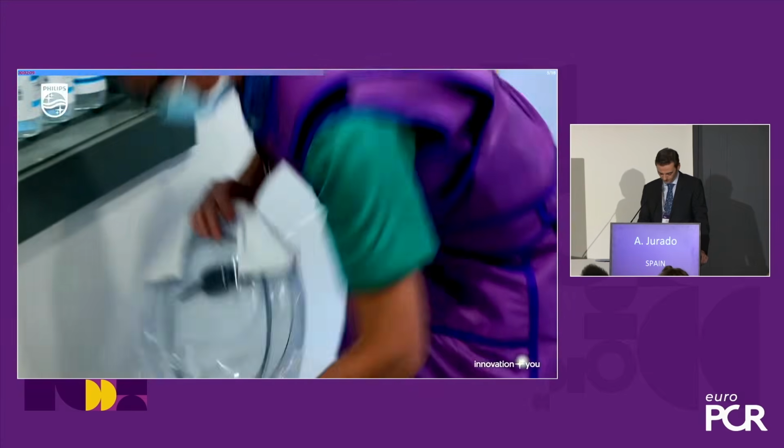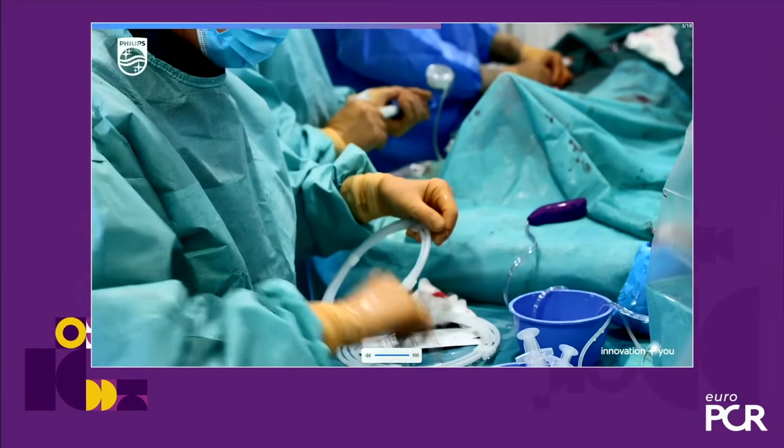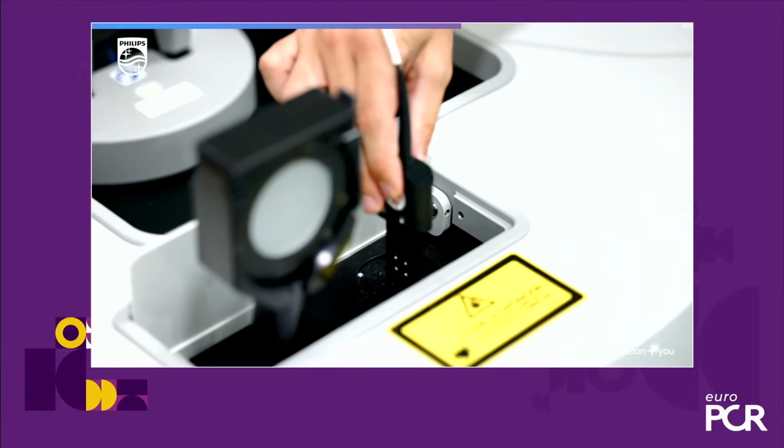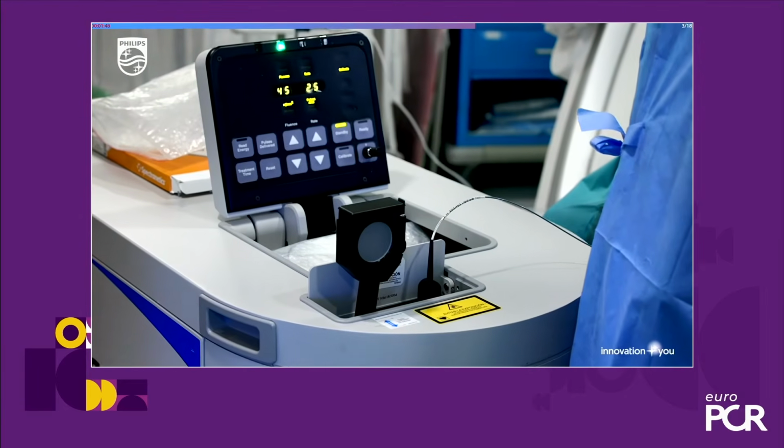So at that point, probably the laser is the most efficient option because, as you know, it is the only plaque modification technique you can use through a 6 French and a conventional guide wire, because rota or orbital needs specific wires, and you need to cross with a microcatheter to do the exchange.